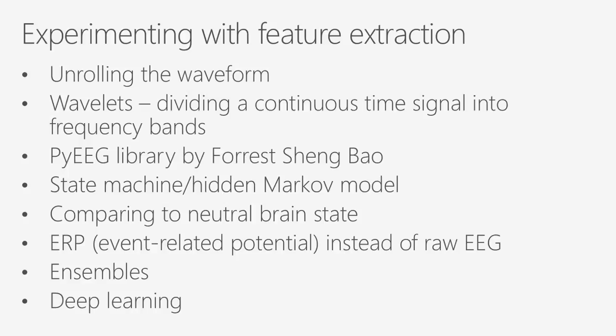And that works okay when everything started at the same time and you can align those, but that can sometimes be difficult to align. Another thing is wavelets. So you can basically divide things into these frequency bands in time, and that's something that's very typically done with EEG data. And there was actually a Kaggle competition around EEG data, and they found that these low frequency time bands were actually one of the most telling things for distinguishing between two actions, which was interesting and relevant to this.